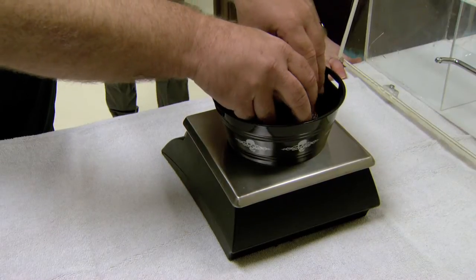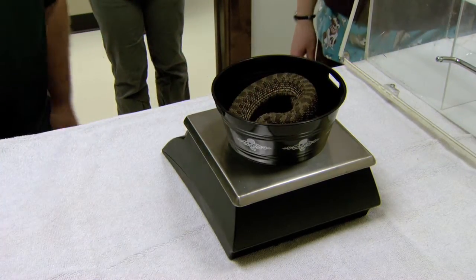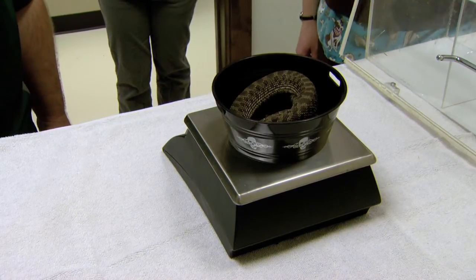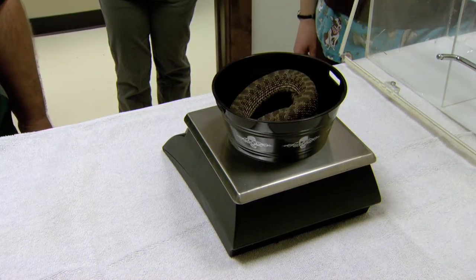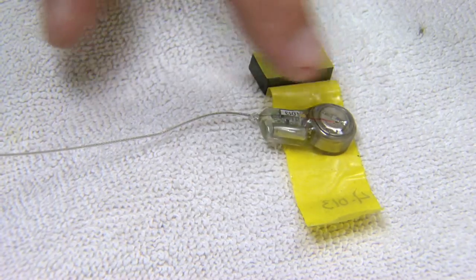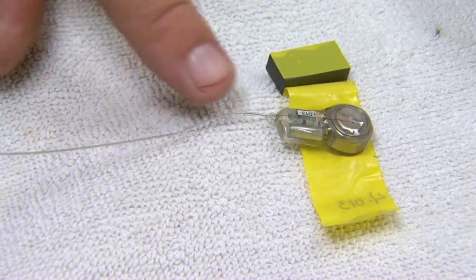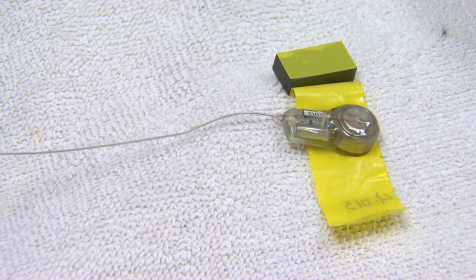We'll get a weight — she is at 183 grams. The snake is very well equipped for the transmitters that we have. This is the radio transmitter; this part is going to go inside the snake. This is going to go subdermally — this antenna here — which increases the read range.